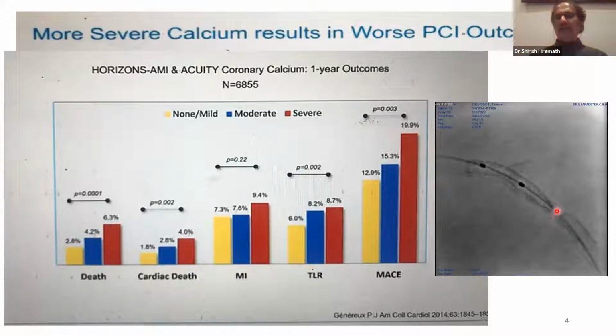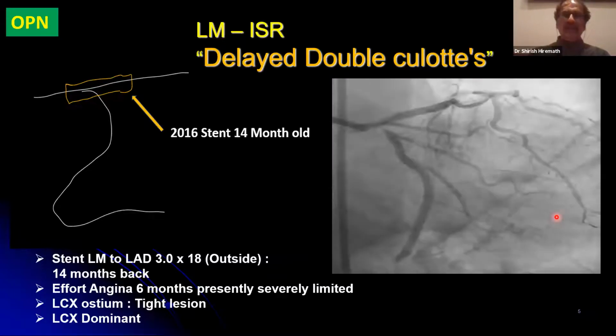So here, this particular area was not prepared, not pre-dilated well, and a stent was placed. The stent did cross this portion, but once the stent has crossed, you can see on stent boost that the stent has failed to expand. So here you would probably take a small NC balloon and go on upsizing this NC balloon and get a full expansion. However, one should never run into a situation like this, that the stent is deployed and is not getting expanded. Here is another case.